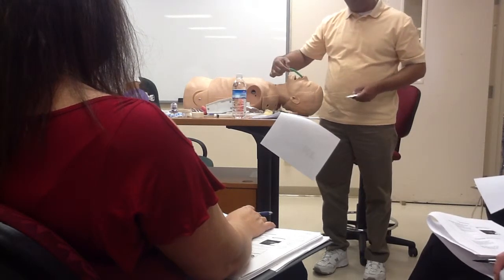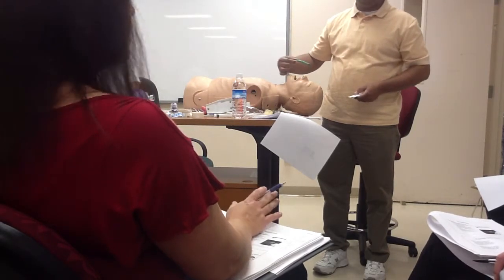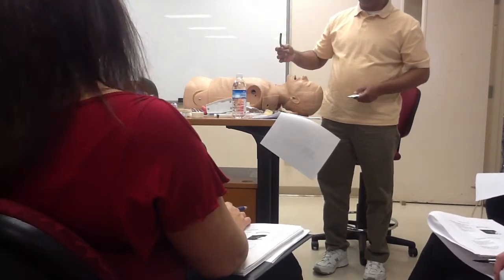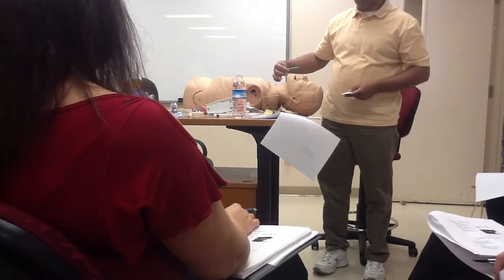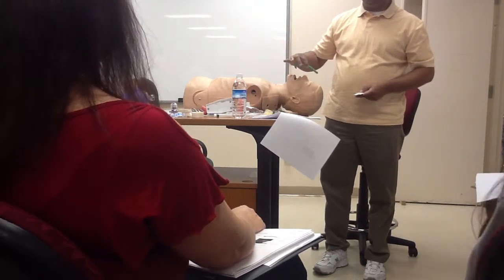If you can't get it through one nostril, try the other one. Don't use force. Do you use regular gloves on this? Regular, this is an aseptic procedure. You do not need to put sterile gloves on. Lubricate, try to insert, and if it doesn't go in, do not jam it in there, go to the next one. So there's no turning or nothing, you just follow the natural curve and you're done?